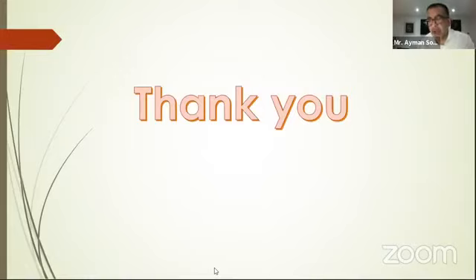And sometimes I use my awl to establish that. But if you've got soft tissue in between, that is not going to work. And the thing is, you just need to get the reduction right before you start your nail, before you create your entry point. Because once you've created your entry point, there's no return. Yeah. Thank you, sir.